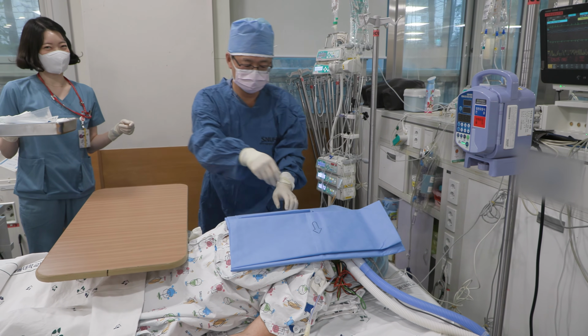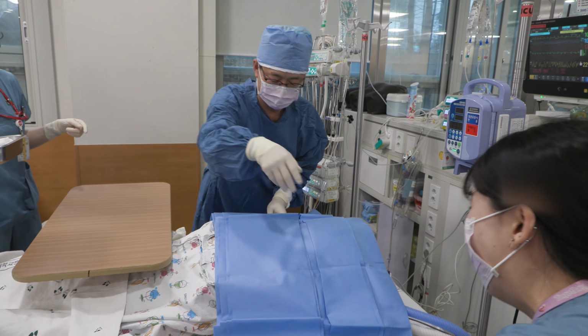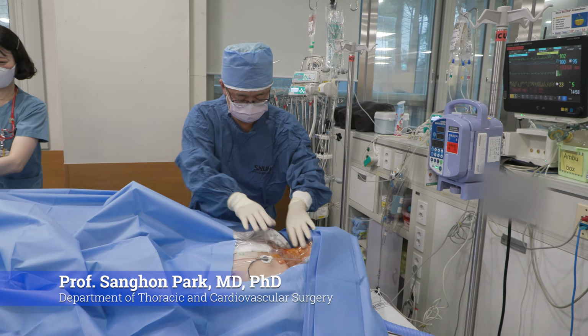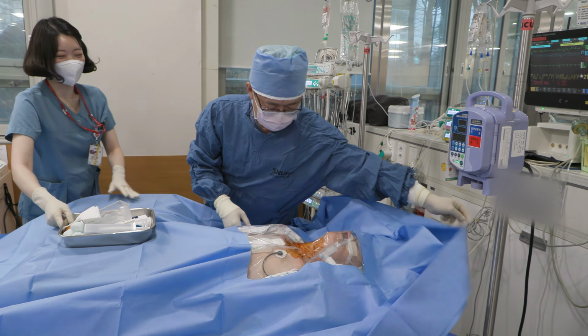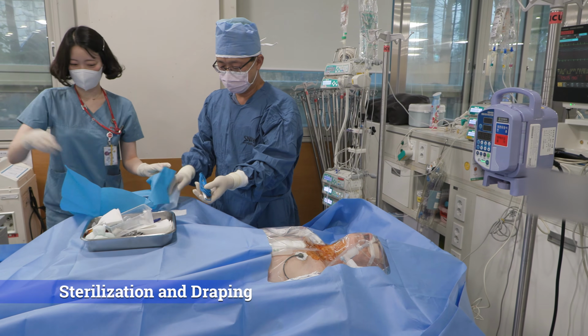Today I will show you a video of performing a percutaneous dilational tracheostomy at the bedside in the intensive care unit. Today's PDT is performed by Professor Sanghon Park from the Department of Thoracic and Cardiovascular Surgery, with Professor Yeonjoo Lee from the Department of Pulmonology assisting by performing bronchoscopy.